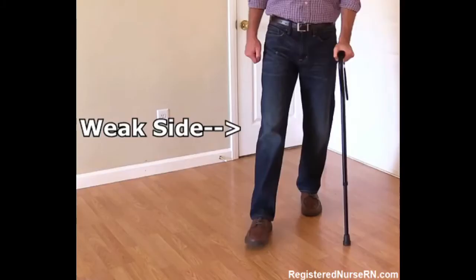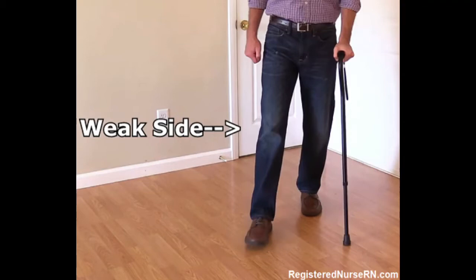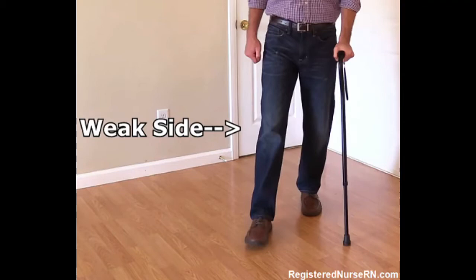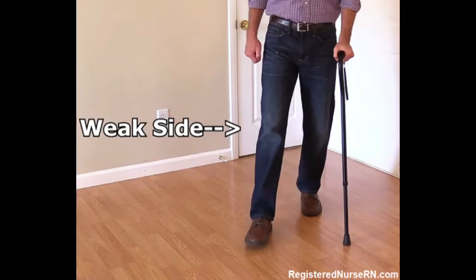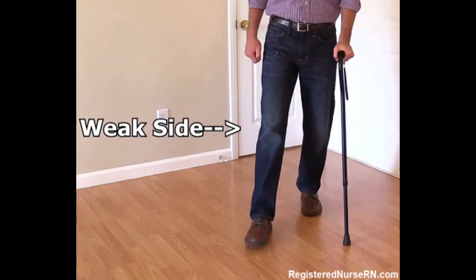Sixth, assist the client in ambulating with the cane. Seven, begin by placing the cane on the side opposite of the involved leg. Eight, place the cane forward 6 to 10 inches or 15 to 25 centimeters, with body weight on both legs. Nine, move the involved leg forward even with the cane. Ten, advance the uninvolved leg past the cane. Eleven, move the involved leg forward even with the uninvolved leg. Twelve, repeat these steps.